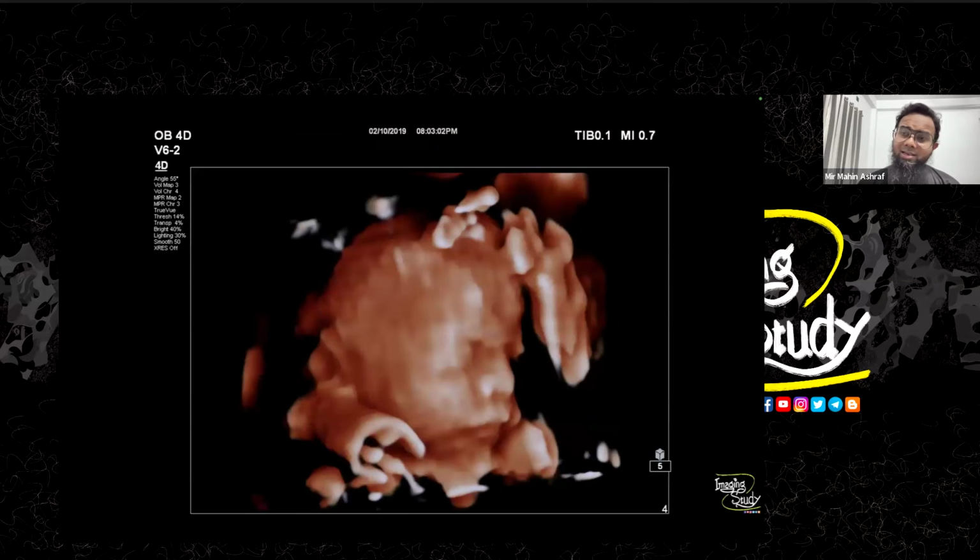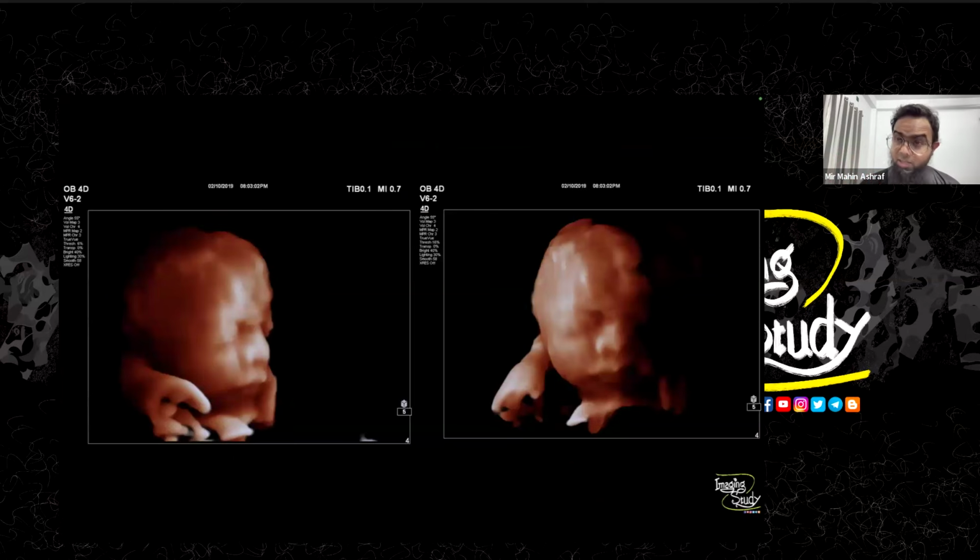Okay, so I edited a little, then the picture comes like this. What I said, you shouldn't get satisfied. So I edited a little more, now the picture comes like this. So I couldn't make a good view of this area. It was distracting. So I decreased the light here and I put the light source from this part. So it gives a cinematic picture.